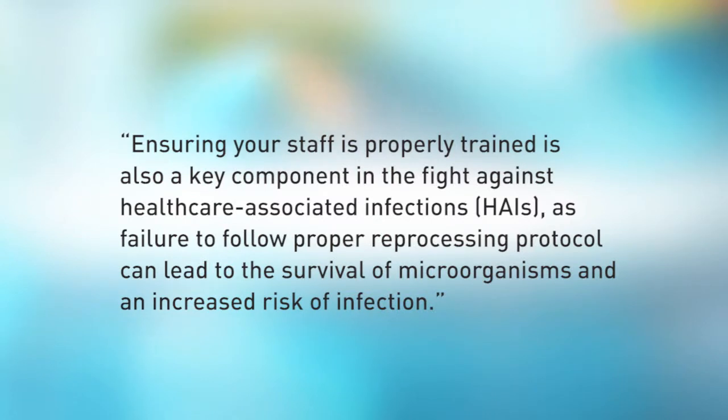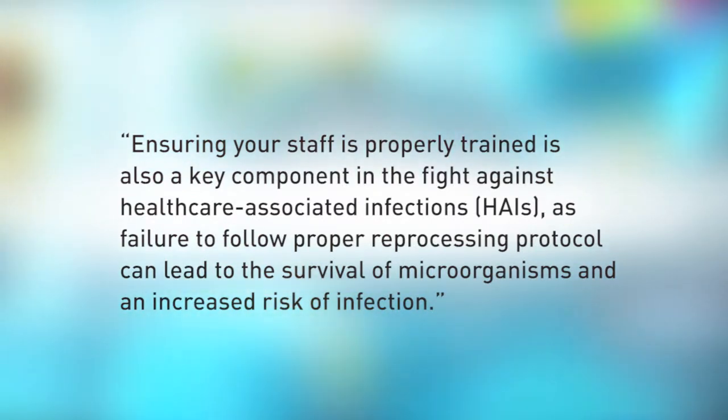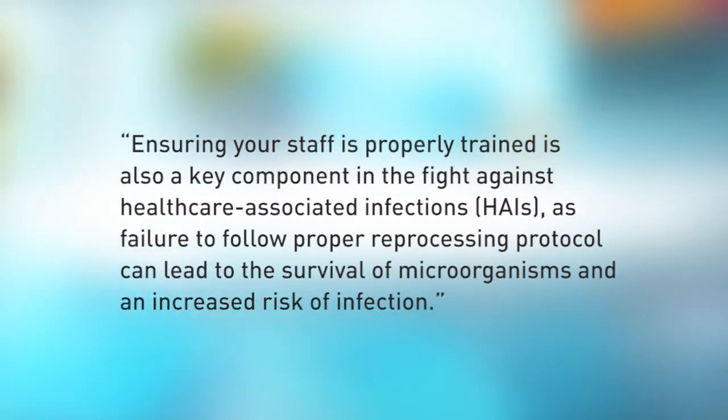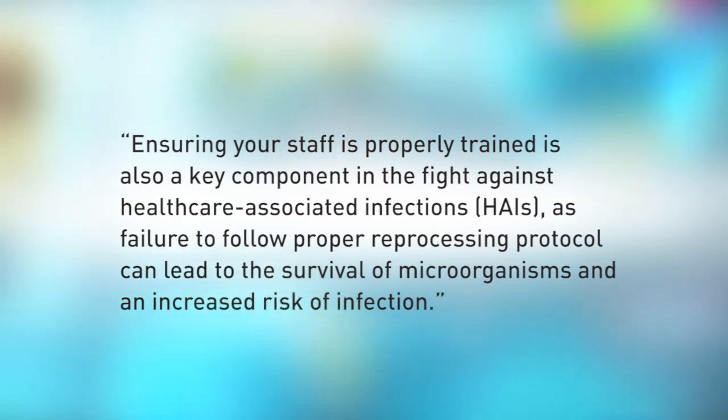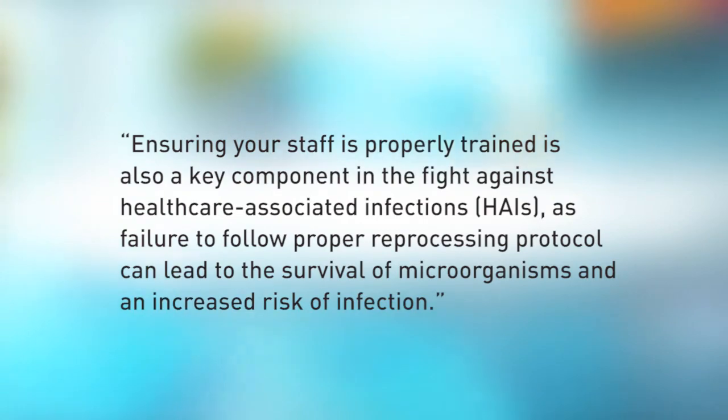Lastly, we'll explore the Society of Gastroenterology Nurses and Associates, or SGNA's standard. The SGNA's Standards of Infection Control in Reprocessing of Flexible Gastrointestinal Endoscopes says, ensuring your staff is properly trained is also a key component in the fight against healthcare-associated infections, as failure to follow proper reprocessing protocol can lead to the survival of microorganisms and an increased risk of infection.